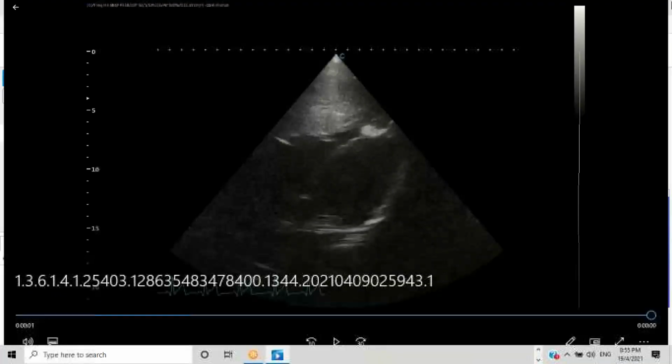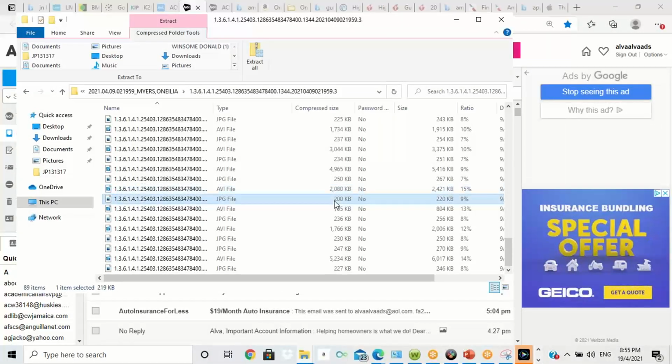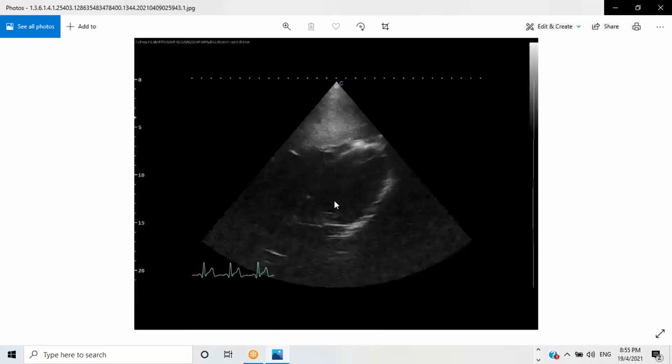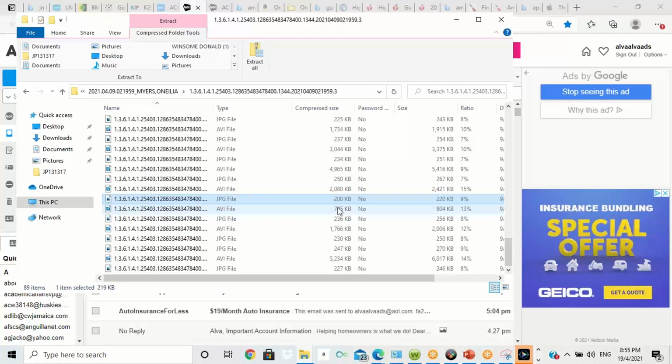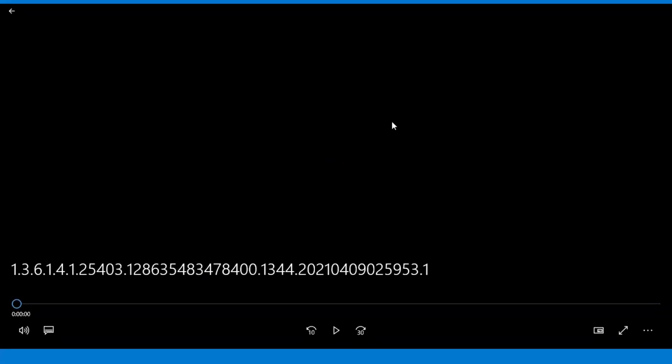So this is your subcostal view, and one of the important things about the subcostal view is that you want to do your Doppler assessment of the hepatic vein flow. That's very, very important. It should be a part of your routine study. Once you start doing your echoes, hepatic vein flow is going to be important. And let's hope we have one here to show you.